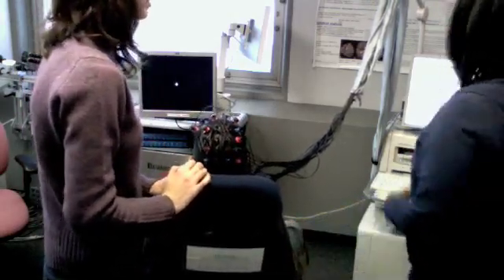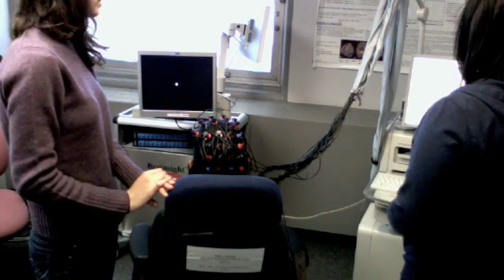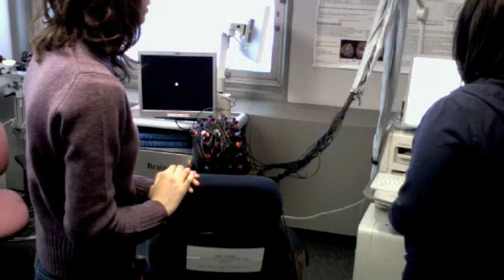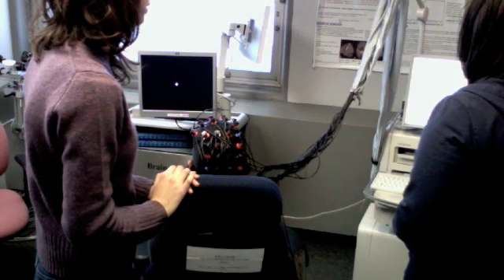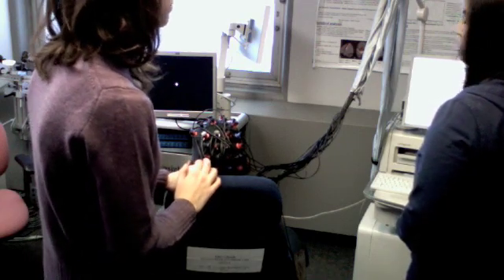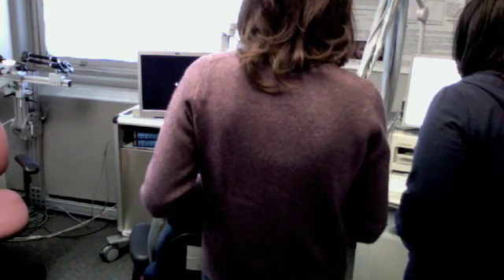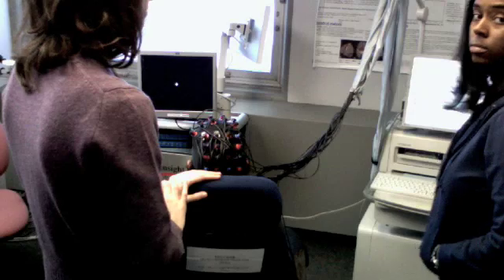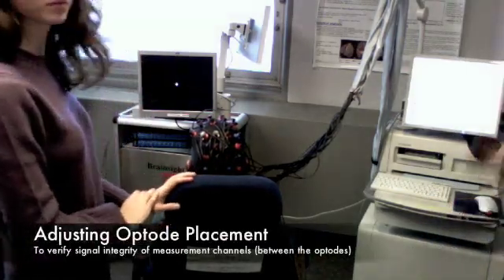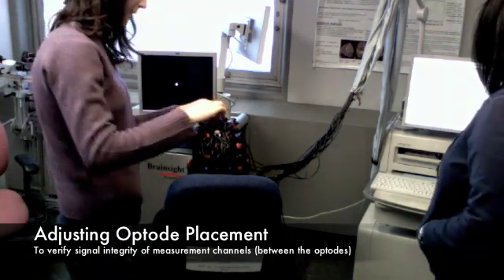Now we're going to be running the computer to see if all the optodes are in place. Now I'm going to be adjusting some of the optodes to make them have a stronger signal.